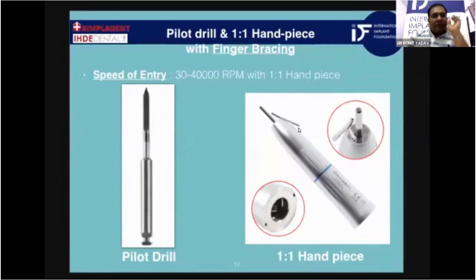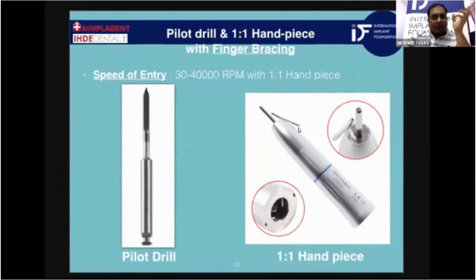Starting with the drilling procedure — first of all, we have to start with a pilot drill using a one-to-one handpiece.